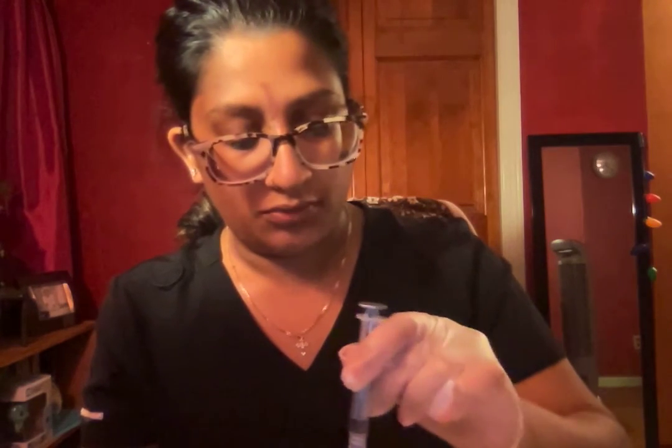And then I'm going to remove the needle smoothly, engage the safety device, dispose the needle in the sharps container, and I'm going to put some gauze on the site. Hold it there for a few seconds, put a Band-Aid on, remove my gloves, perform hand hygiene. I'm going to place the patient in the lowest position for the bed.